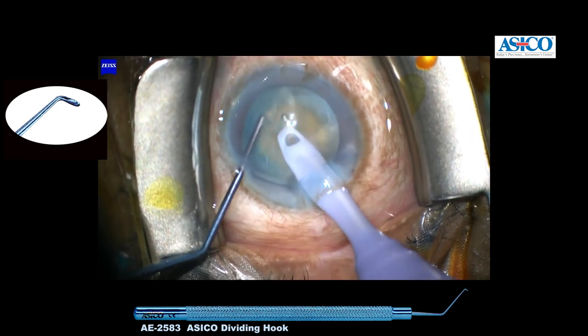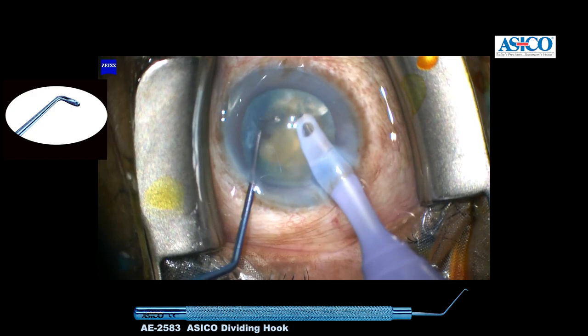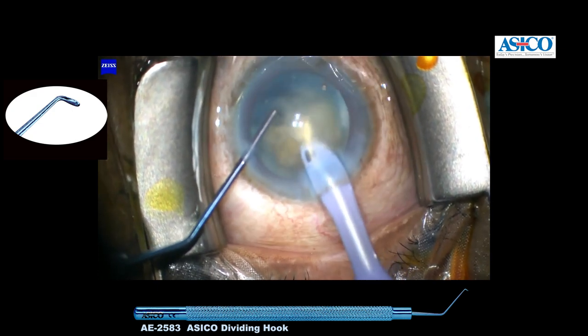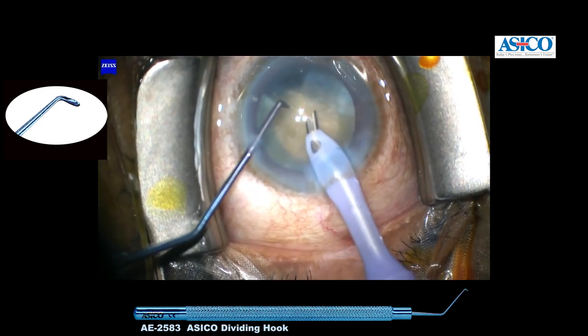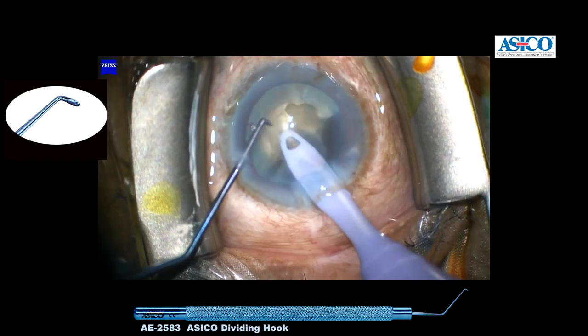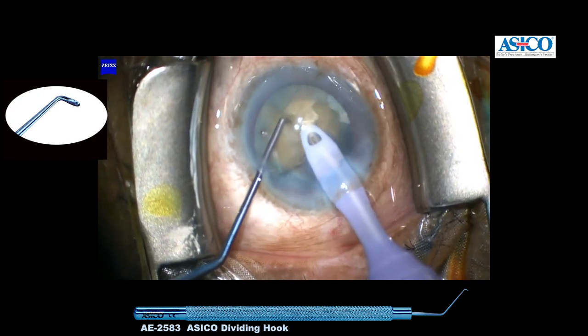If I demonstrate a hold, you can see the entry and the separation. The leverage that we get for the separation is extremely good. Then again: the hold, the entry, separation.